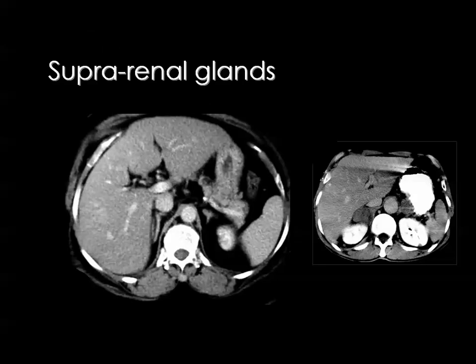We continue scanning the chest until we can see the suprarenal glands, because in bronchogenic carcinoma a common site of metastasis is the adrenal glands. Instructions are given to the technician to continue scanning until the suprarenal gland is visible — it appears like an inverted Y above the upper pole of the kidney. Bilateral metastatic deposits in the suprarenal glands from bronchogenic carcinoma can be demonstrated on CT.